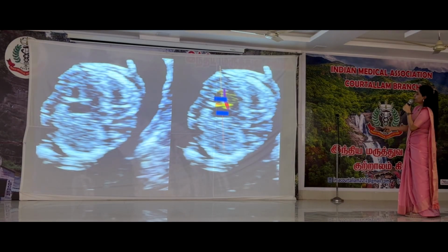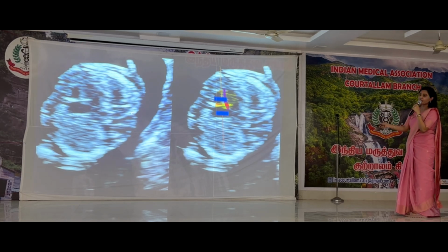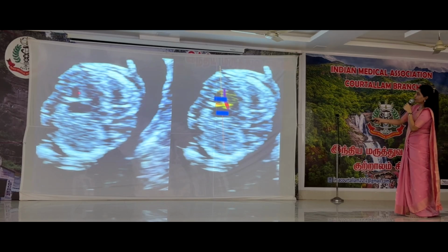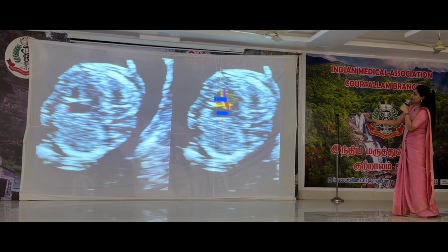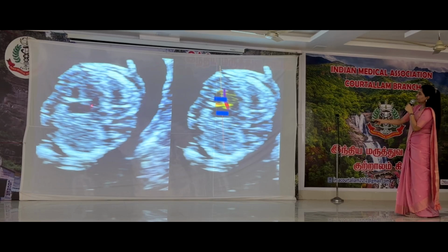Next, coming to the next marker, the tricuspid flow. To get this, take the fetal thorax in axial section. The apex should be pointing upwards. Do not switch on color. If you switch on color, you are not able to see the tricuspid valve separately. You keep it like this and you can see all 4 chambers of the heart. This is the left ventricle, right ventricle, right atrium and left atrium. These are the atrioventricular valves, the mitral and tricuspid valve. This is the interventricular septum.